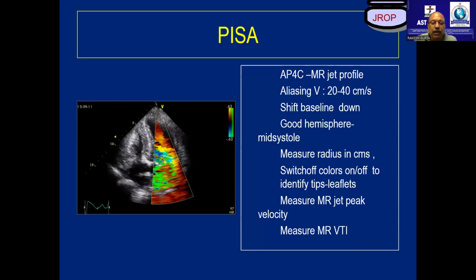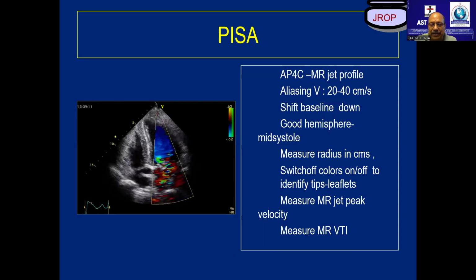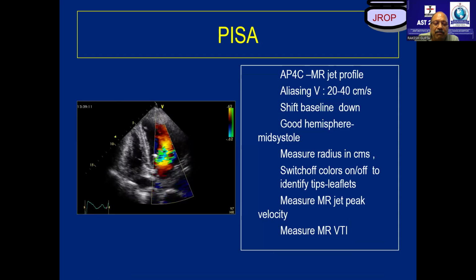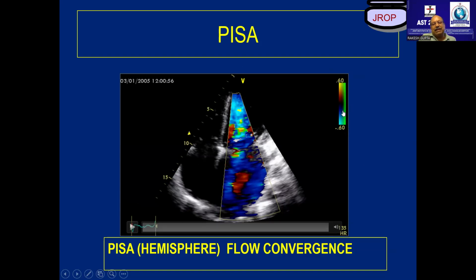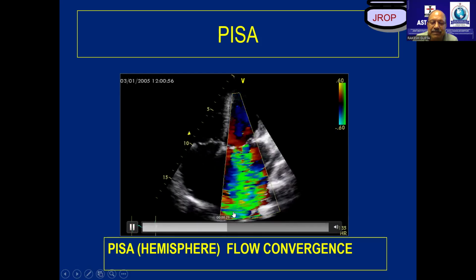Right? Now let's do it. What exactly do we do? First of all, when we see a severe mitral regurgitation, we move this baseline downward in the direction of the jet. So this will become 80 to 100 and this will become 20 to 40. So I'll move this scale down. There's a button on the line where you move this line down. As you move this line down, these hemispheres become much clearer and bigger in size, giving you a real value to look at these hemispheres.